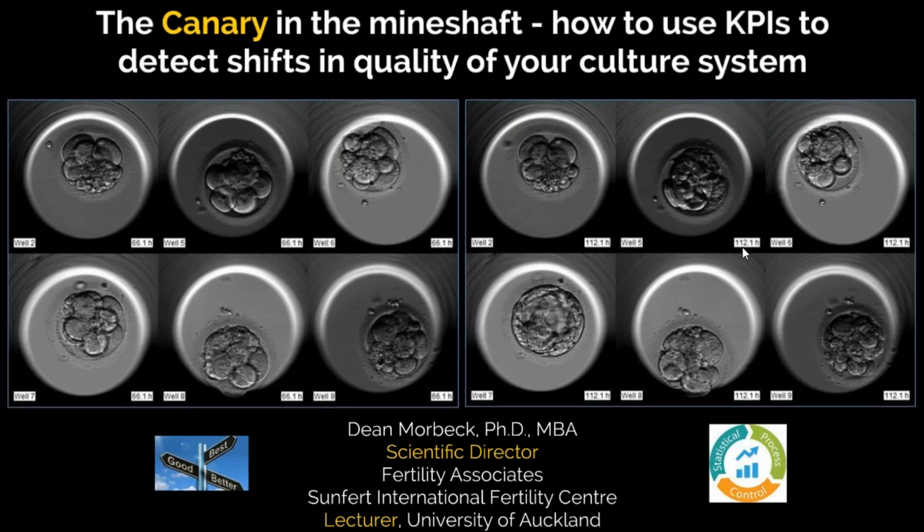Wow, that's a lot of questions in that one question. I don't know exactly what you're referring to in terms of procedures, but the point that you raised that I think is worth mentioning is that if you're looking at day 5 blast rate, the one thing that we haven't controlled for, and that is definitely a criticism that we're going to have to deal with, is do we always look at the same time on day 5? And could that be a variable? If we're doing our checks in the morning and the afternoon, and we're freezing at both times, and you get more in the afternoon than the morning, you might see a subtle shift that you miss. So I think it's worth standardizing further.